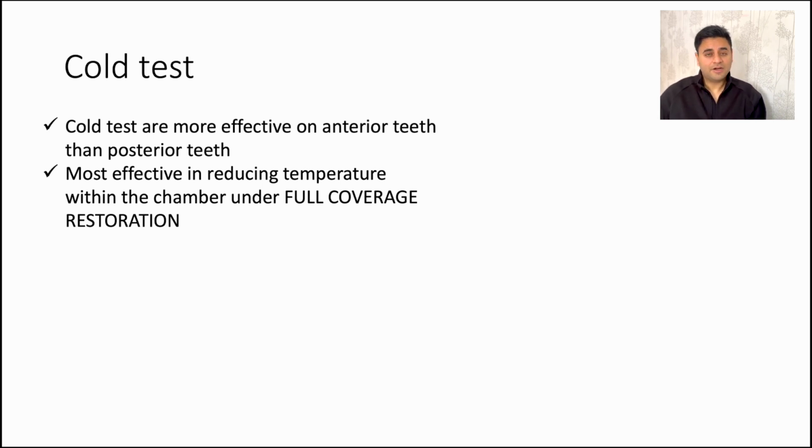You cannot do an electric pulp test on a crown, and if you warm up gutta percha and just apply it for the heat test, then that's definitely not going to work much on a crowned tooth.